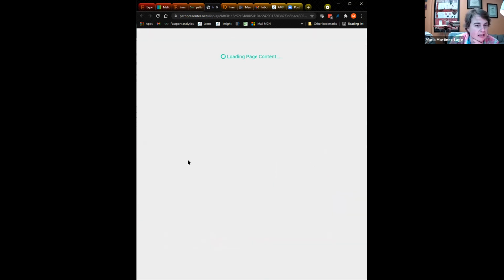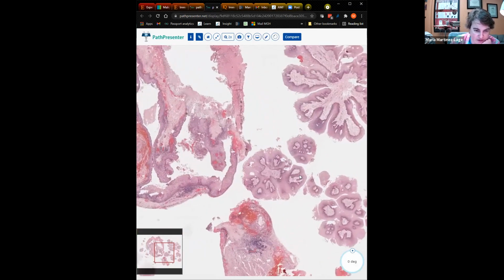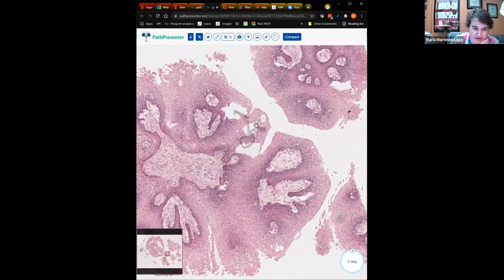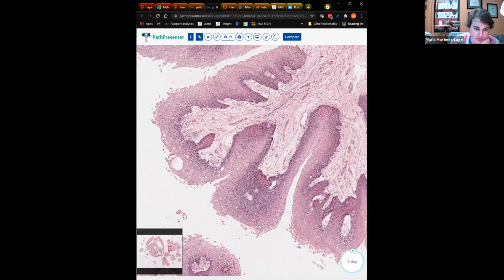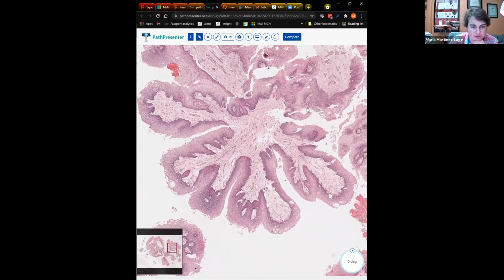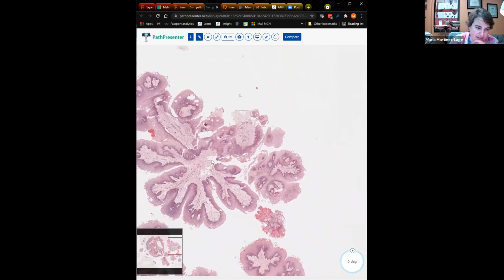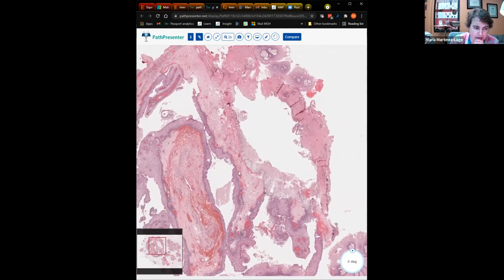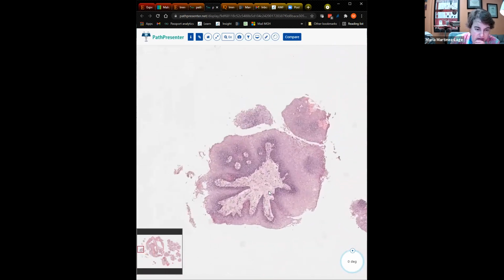Then we have papillary craniopharyngioma. It is, again, a very different type. So papillary craniopharyngioma is also composed of squamous epithelium that's usually thicker than the epithelium that you see in the adamantinomatous type of craniopharyngioma. And then the growth is somewhat papillary, but notice how it's not very delicate papillary cores that you might see in other papillary tumors. So these are almost arboriform-like areas of squamous epithelium overlying these relatively thick cores again.